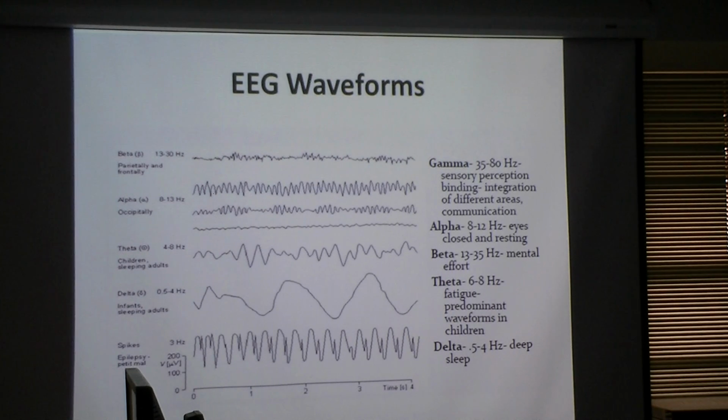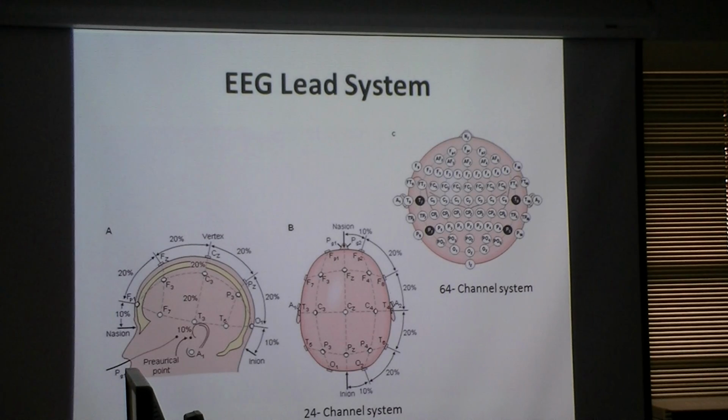To take the EEG, we use electrodes in a mesh kind of structure, a kind of net we put on the head. It has electrodes, and it can be a 24 channel system. The experiment readings which I took are from a 16 channel system. It can go up to a 64 channel system. So with the increasing channel count, we increase the accuracy, or you can say the resolution. So these are the points from where we take the readings.